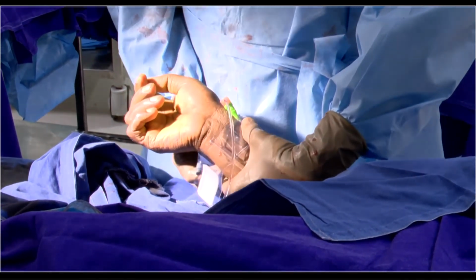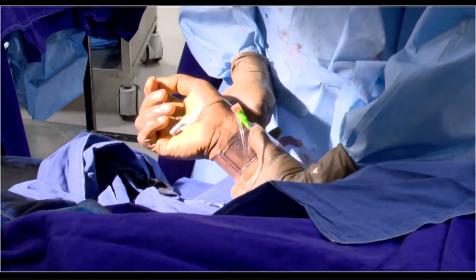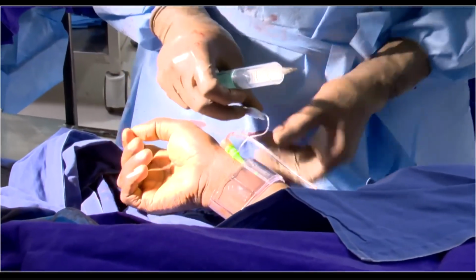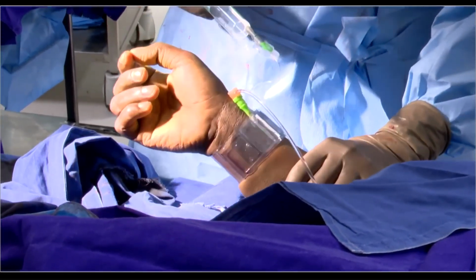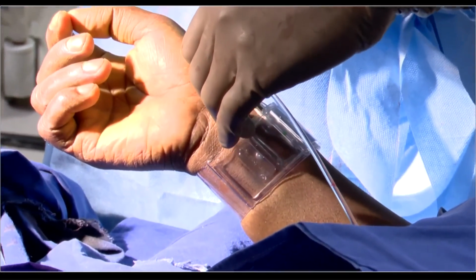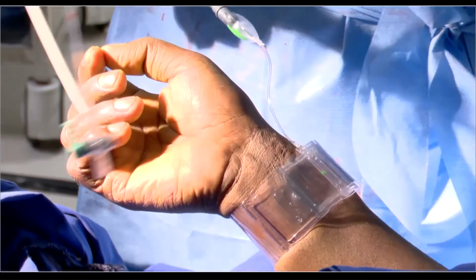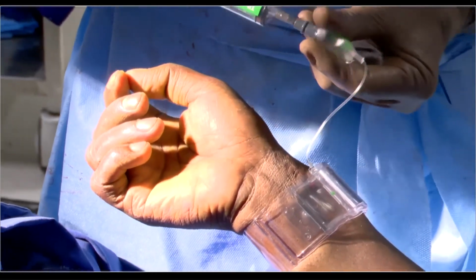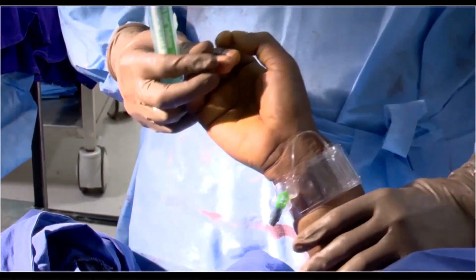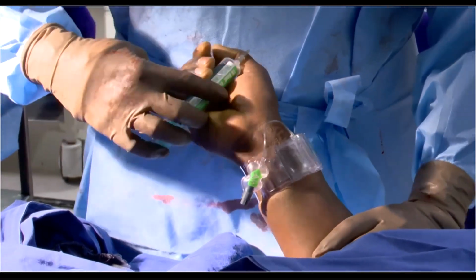So I decided to put a TR band for hemostasis of the radial access, so the patient can move his arm very easily. So this is the TR band. I have 15 ml of air in the TR band, and I'm going to inject slowly and remove the sheath as I inject. Okay, so that's the TR band done. That will make hemostasis much easier and preserve his radial artery for future access if we need it. Thank you.